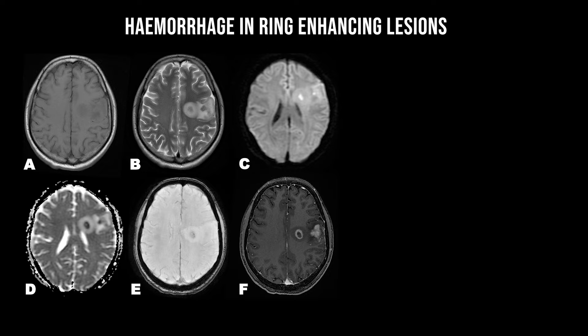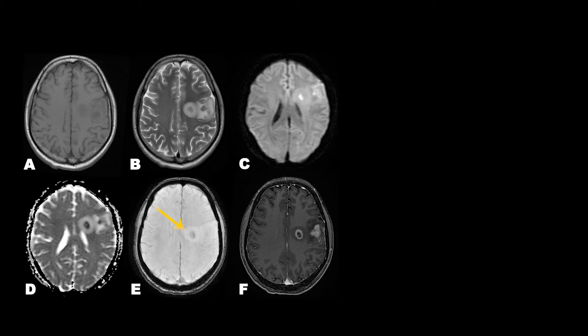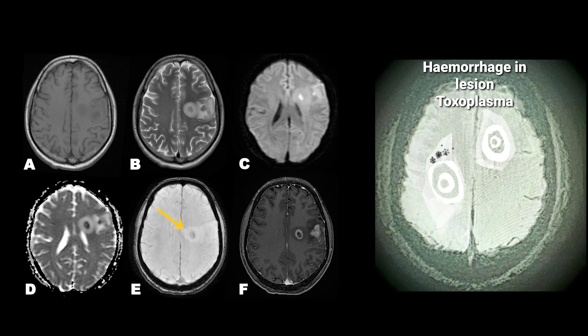Hemorrhage in ring enhancing lesions is seen most probably in toxoplasmosis, where the wall can show hemorrhage. In glioblastoma, hemorrhage can be seen due to neovascularity. This is a case of toxoplasmosis in an immunocompromised patient — you can see central restricted diffusion and also hemorrhage in the susceptibility-weighted images, showing hemorrhage within the walls.